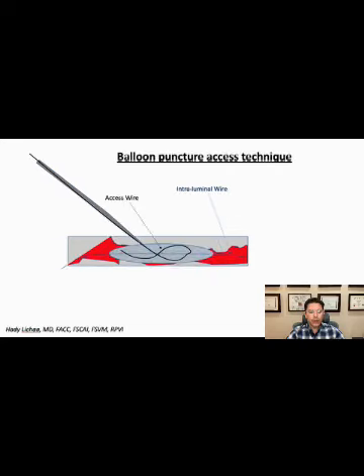access with a wire, and again, the reason why the operator cannot proceed with the intervention from that initial access is either limitations related to distance with the length of the interventional equipment that would not be compatible, or with the fact that the distal or proximal access site is too small to introduce large caliber devices.